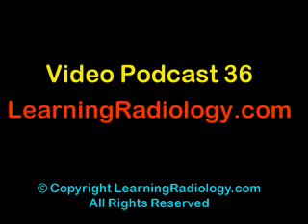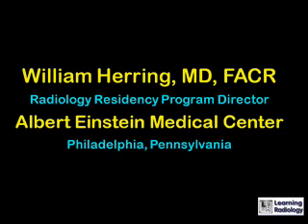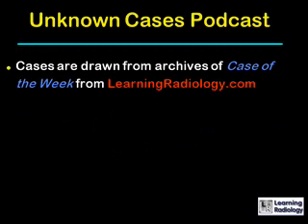This is video podcast 36 from LearningRadiology.com, 10 More Great Cases, Part 3. I'm William Herring from Albert Einstein Medical Center in Philadelphia. These are unknown cases drawn from the archives of Case of the Week from LearningRadiology.com.